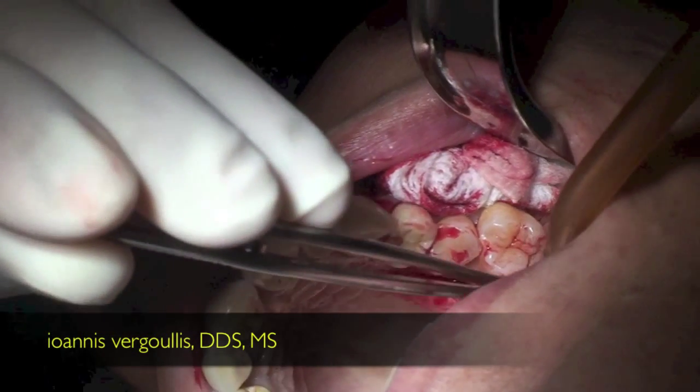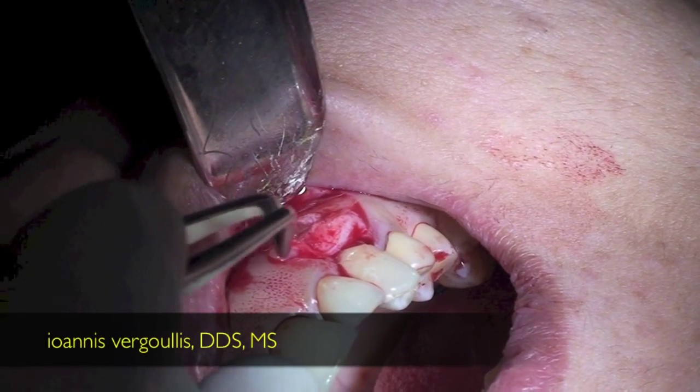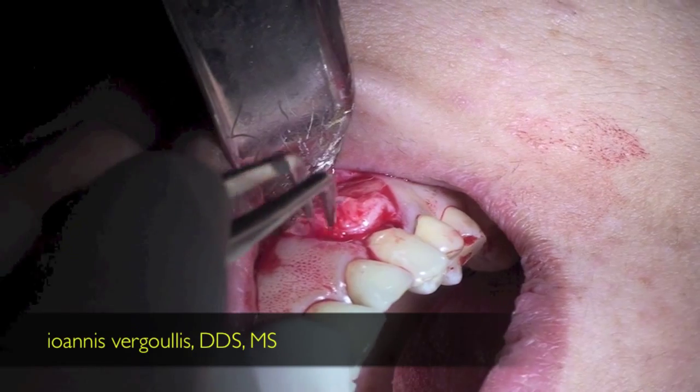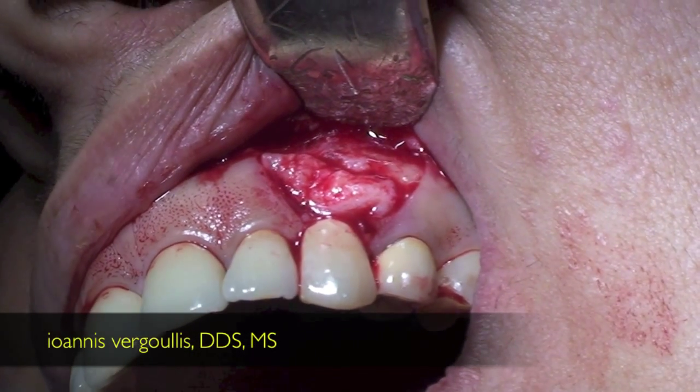We take a connective tissue graft from the palate utilizing a one incision technique and we place the graft into position in order to evaluate the amount of tissue we were able to obtain in comparison to the defect present.